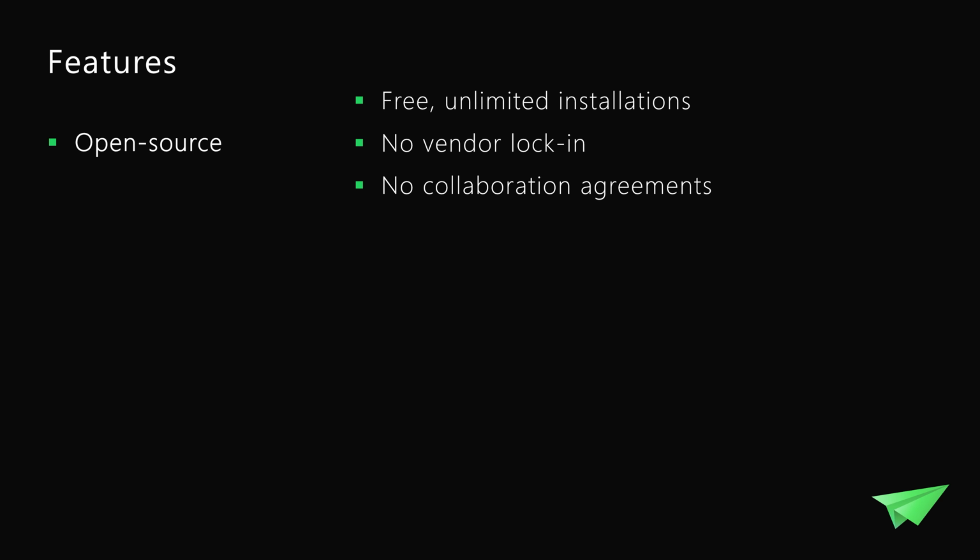So these were some examples of how you can use Mercure. What are the advantages? First of all, Mercure is an open source platform, which means it's completely free to use and you can install it on as many servers as you like.